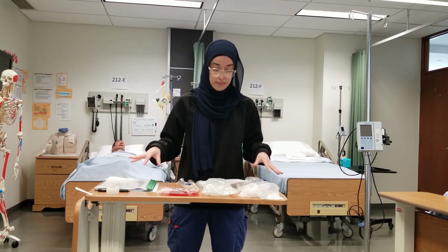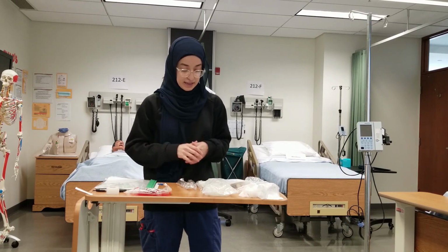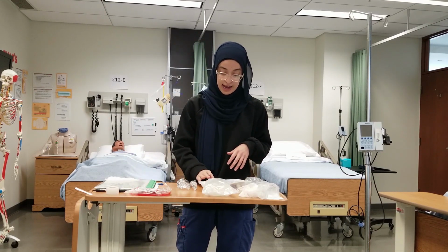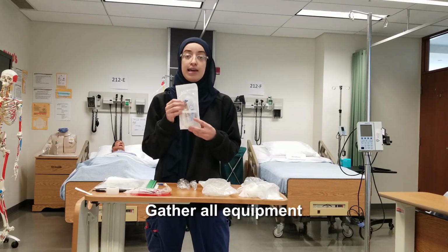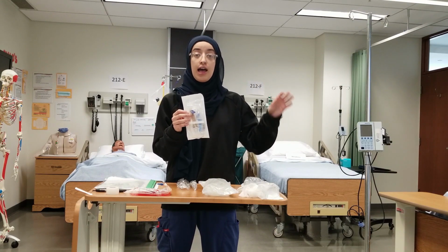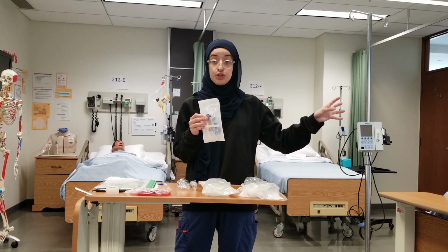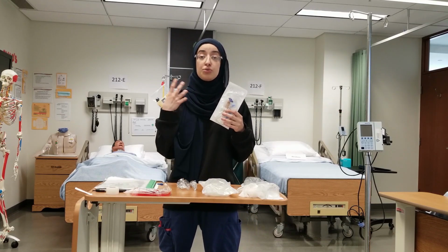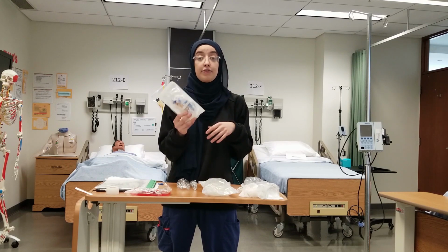So I've collected all my supplies, disregarding the blood because that is at the blood bank. I have my flushes, I have my swabs, and I've got an extra set of primary tubing. This is because if the patient has a reaction during the transfusion, I want to stop the infusion, remove that tubing, and then I might have to flush their body in general with fluids using a different set of tubing.